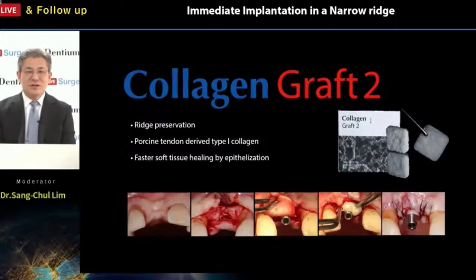For example, if the collagen material sustains the defect area with grafted material for too long, new bone formation is not possible, because there is no empty space for bone cells to form new bone. But if the collagen binder resorbs too early, it means softer physical properties, so it is difficult to handle and mold, and less stable when the bone grafting material is applied on the defect area.